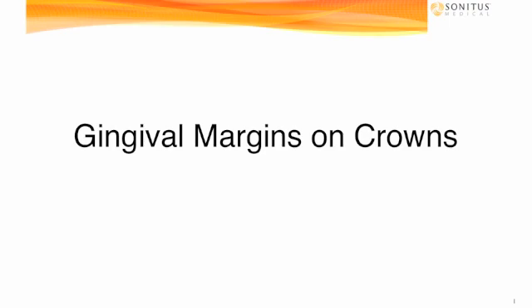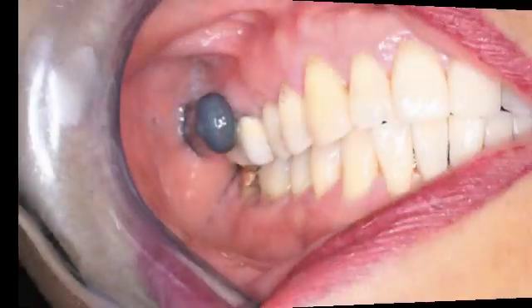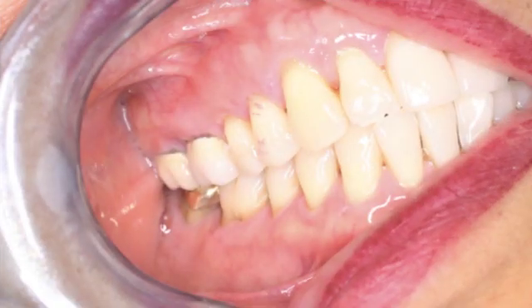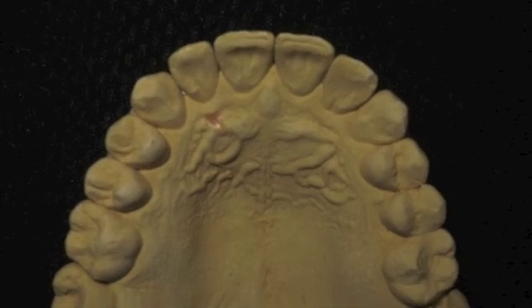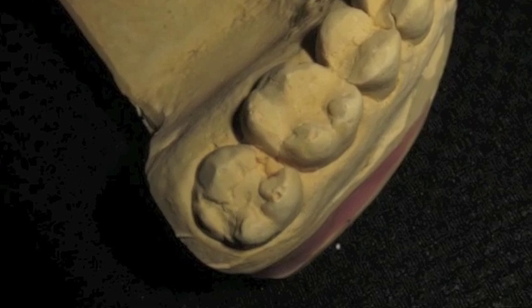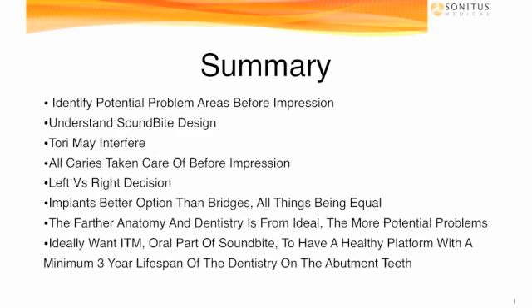Gingival margins on crowns can also be an issue in that the actuator will move up into the gingiva if the crowns are poorly contoured up toward the gingiva and potentially cause a little blunting of the papilla. So watch out for over-contoured crowns and margins way up high. Caries should be detected before we get the model in-house here at Sonitus, because in this case, this patient had a cavity on tooth number 15. You can see it's quite large, and we wonder if there are cavities on the other side. So please treat that before taking the impression.